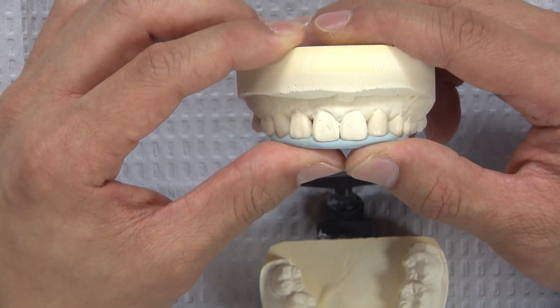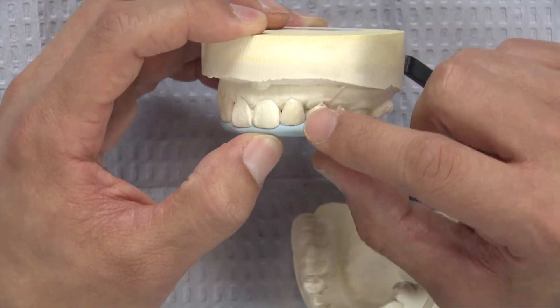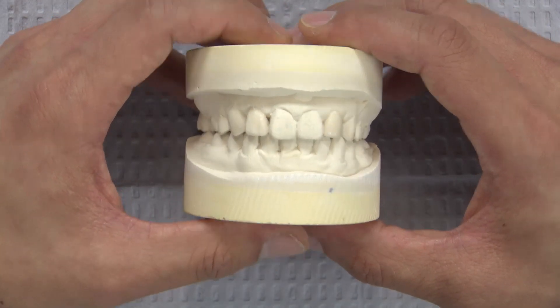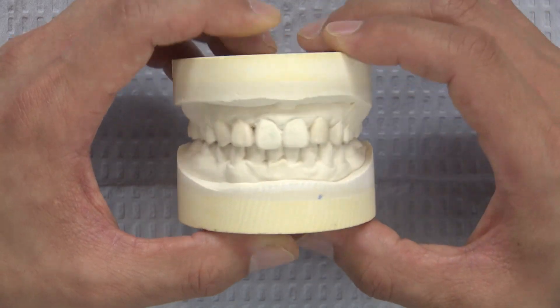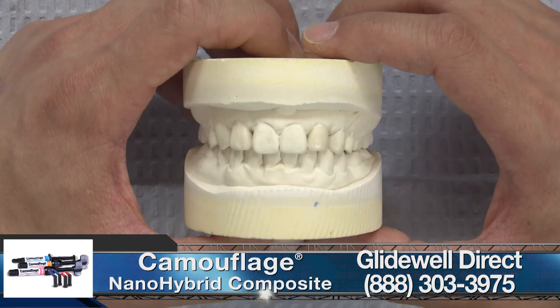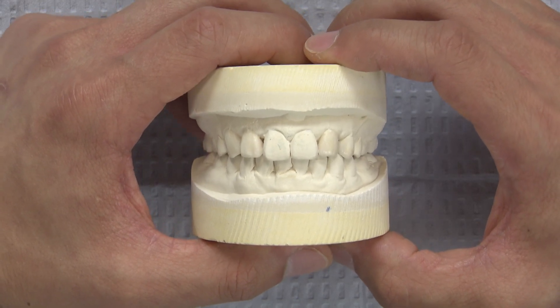The putty matrix is positioned along the incisal edge, which allows me to see intraorally the planned position of the incisal edges. The scalloping also helps me determine exactly where to position the interproximal areas on each tooth. For this case, we are going to use the most minimally invasive approach — the only area we're removing tooth structure will be on the incisal edge of number 10. The rest of the areas we will apply composite resin. The material I'm planning to use will be the Camouflage Universal, a nano hybrid composite with many desirable properties that will benefit both myself and the patient.